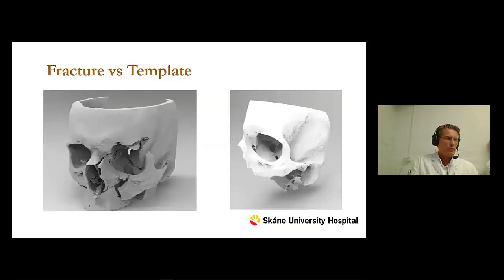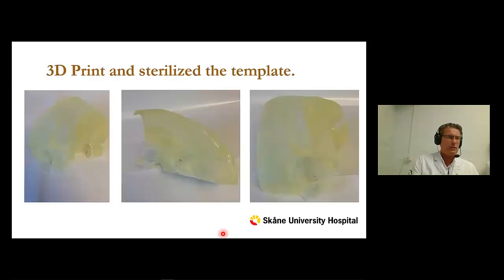So here we have the trauma case on the left photo and our template on the right side. I forced Erik Ekblom to print this on a Saturday, and I forced Einar to take this 3D printed model to the sterilization department on the Sunday, because the operation was on a Monday. The next slide I'm going to show you is of the operation, so if you want to turn your screens off, do that now.